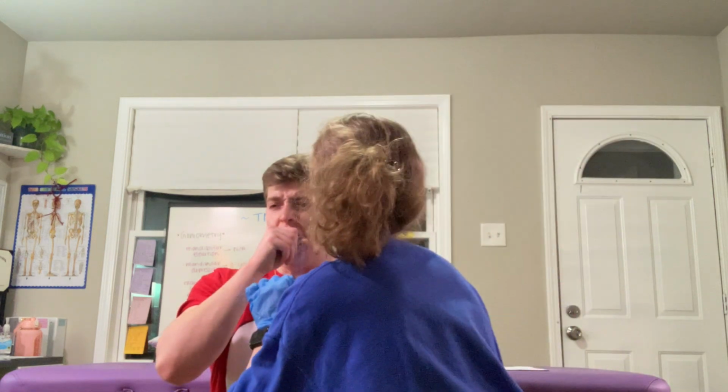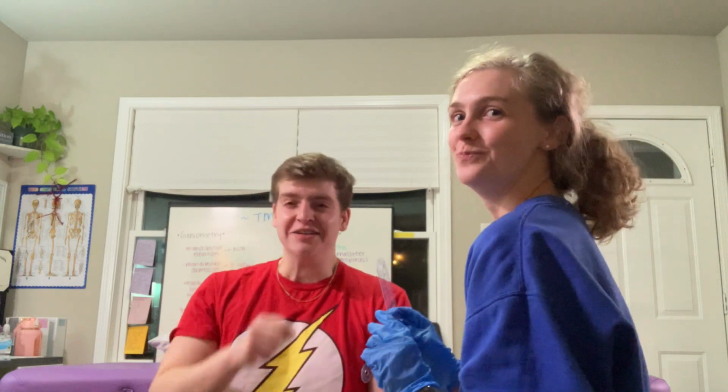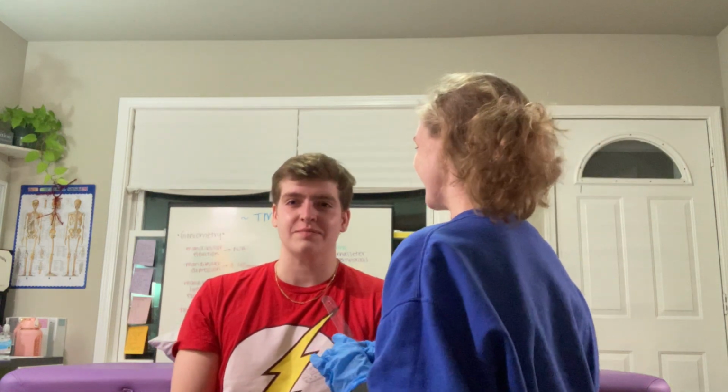So first we're going to have the patient perform mandibular depression. And back up. There we go. And now we're going to measure it. Alright, so we're going to smile pretty for me.